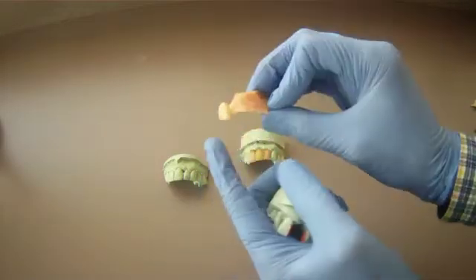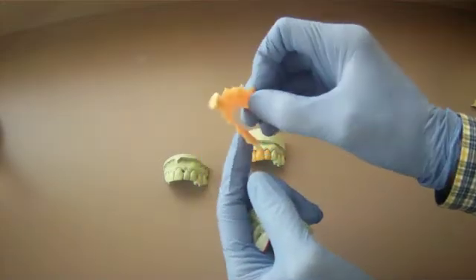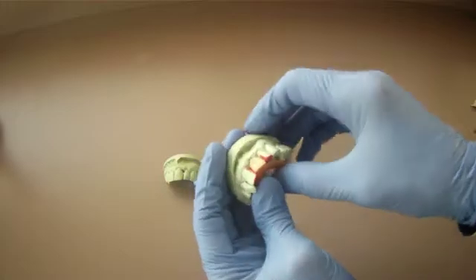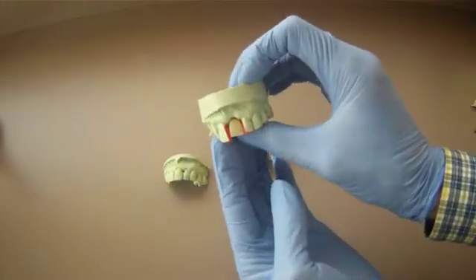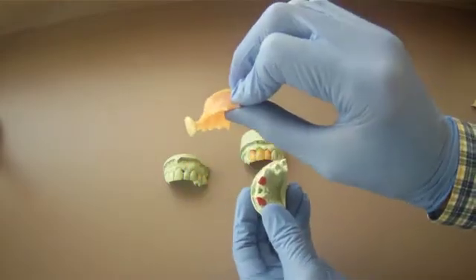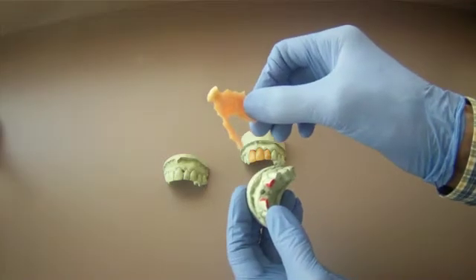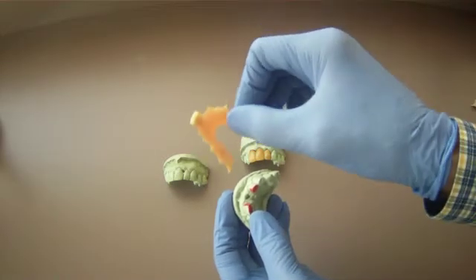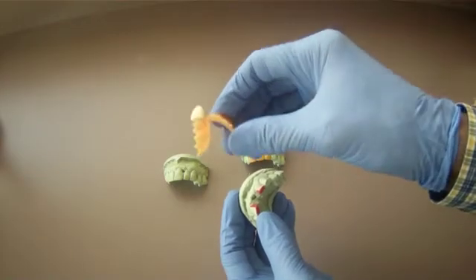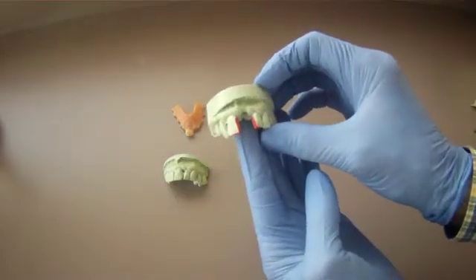It's a device that has a tooth affixed to an acrylic or plastic base. This is made in the laboratory. It takes about a week or so. And it's made like this so it will replace the missing tooth. It's very cumbersome and problematic. It can break quite easily, get lost. The dog can chew it. And many people have misplaced it on the trays at work and after eating. So it's not really the best system. So you have this kind of a condition.